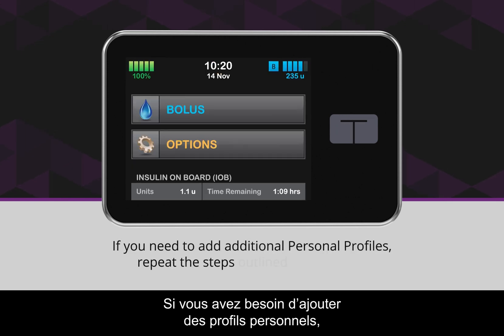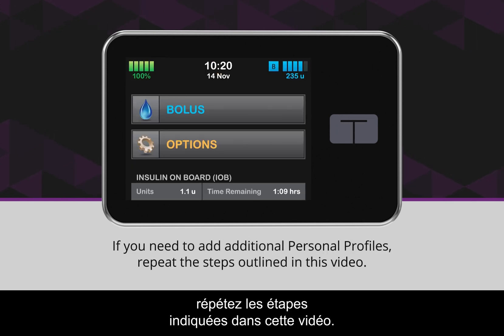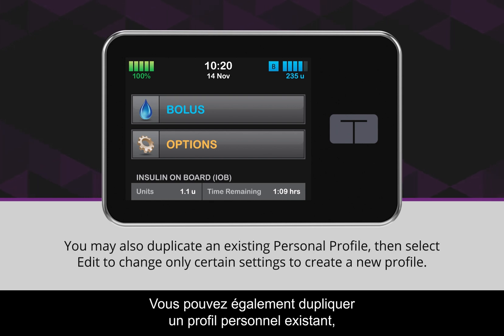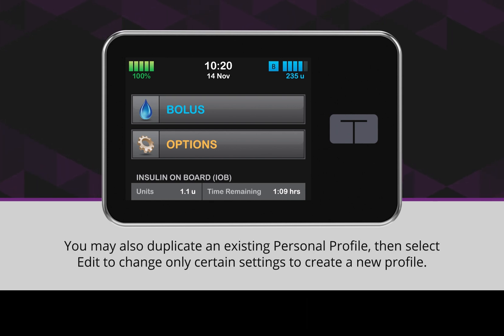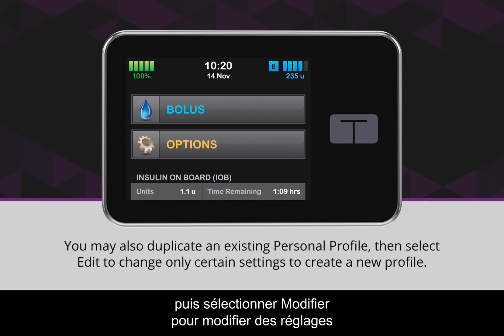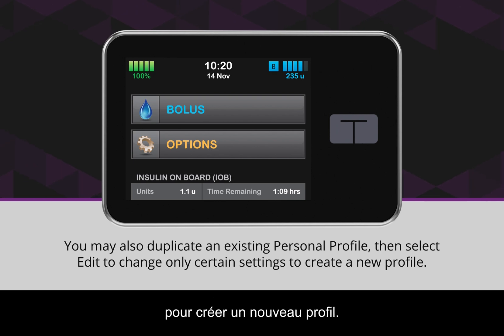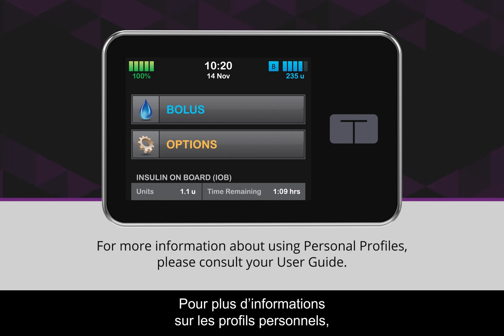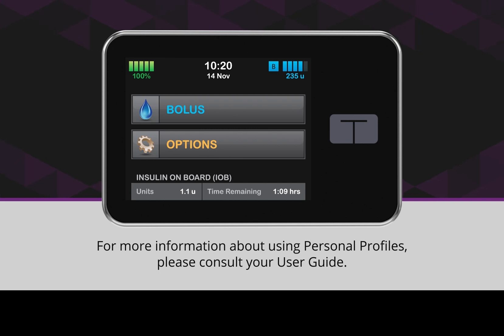If you need to add additional personal profiles, repeat the steps outlined in this video. You may also duplicate an existing personal profile, then select Edit to change only certain settings to create a new profile. For more information about using personal profiles, please consult your user guide.